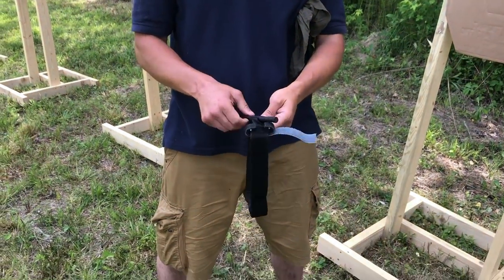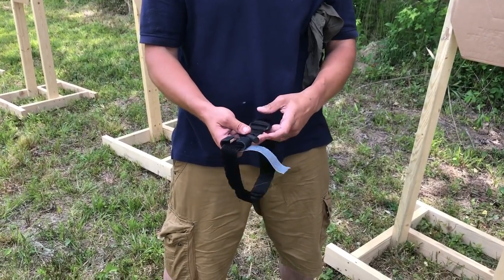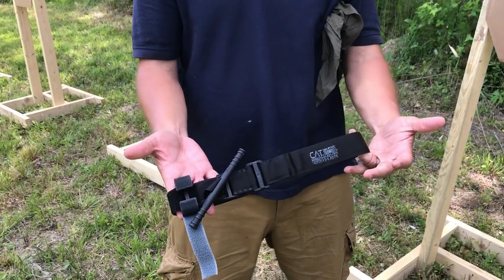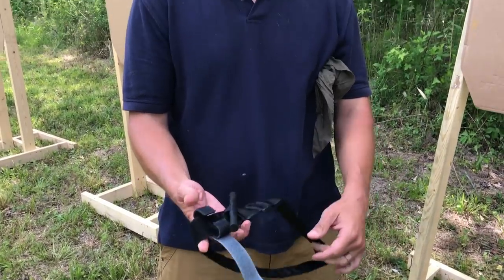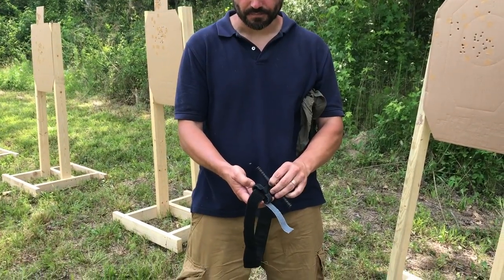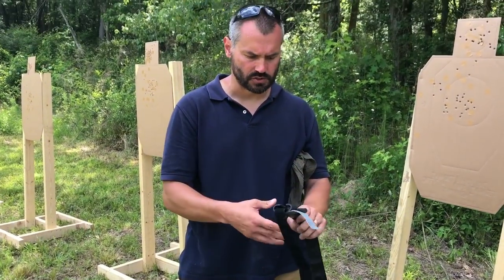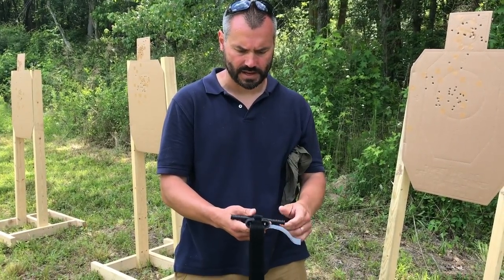This particular CAT tourniquet here is a generation 7. You can tell by the nice beefy rod and the gusseted hooks here. These come out of the package ready for one-handed application, and the idea is that you twist this rod and it tightens up the inner strap, which in turn takes the slack out of the outer strap — and that's what gets you occlusion of a massive bleeder.